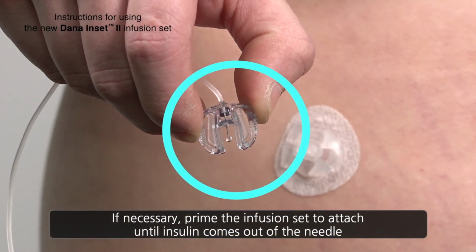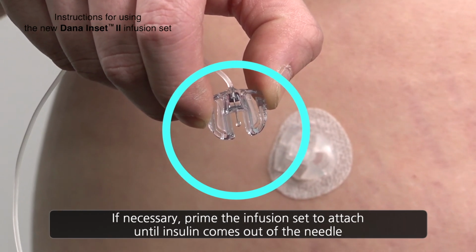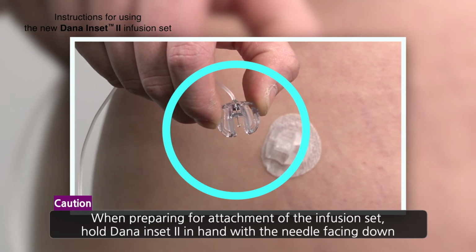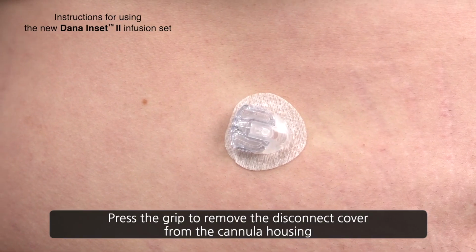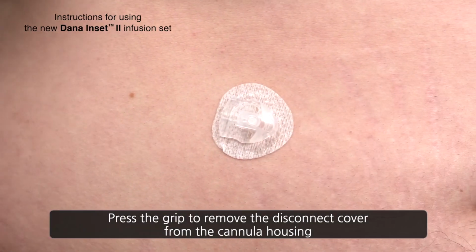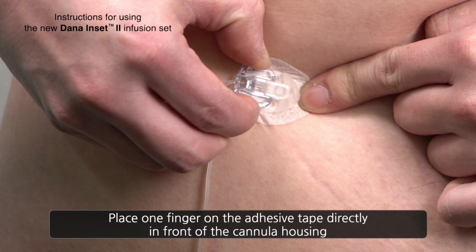If necessary, prime the infusion tubing until insulin drips from the needle. Caution: always prime with the needle facing downwards. Gently depress the ridged grip to remove the protective cover. Place one finger on the adhesive tape, directly in front of the cannula housing. This is the same method as removing the tube earlier.